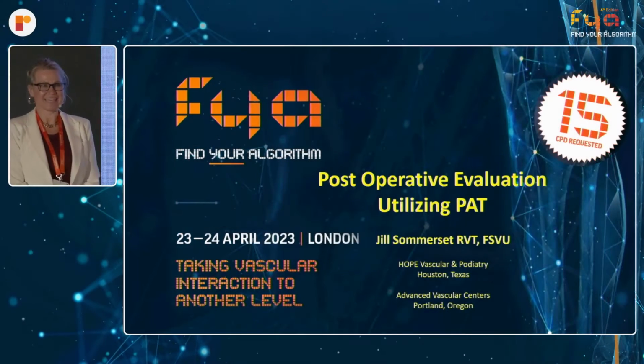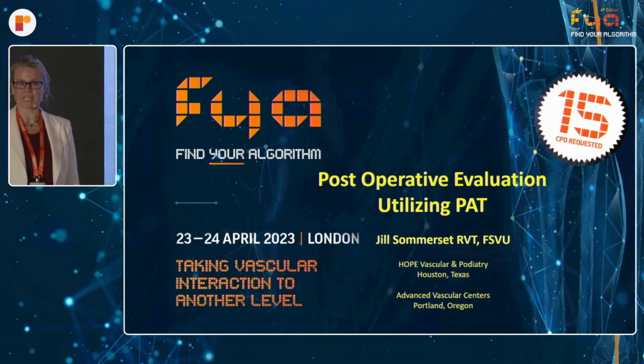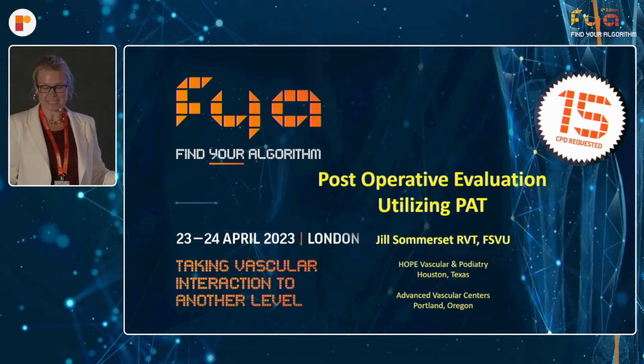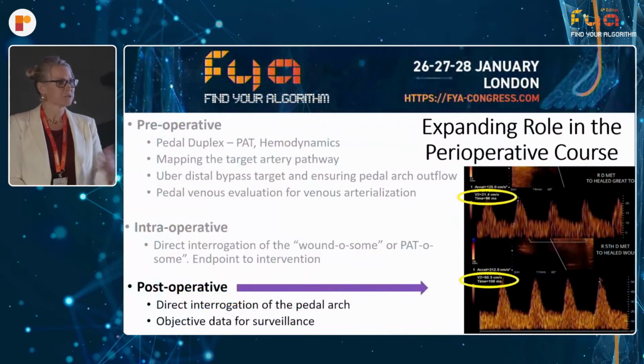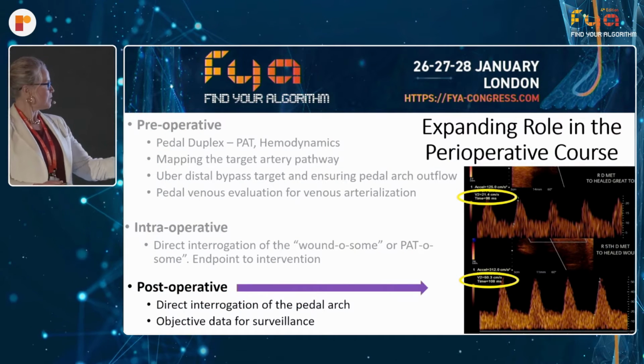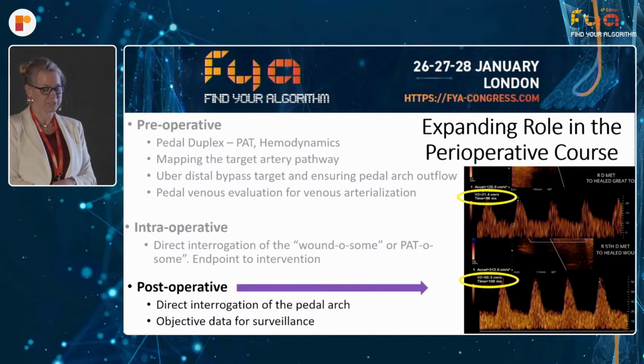Thank you, Lorenzo, for the invitation to be here. I'm very excited to talk about post-operative evaluation using a tool that's widely available to us, which is ultrasound. We usually have them not only perioperatively, but in the cath lab as well. So I'm going to follow up with why ultrasound is so important in the post-operative space.